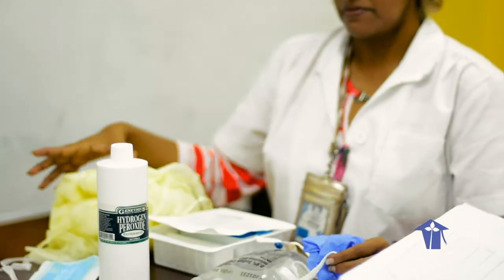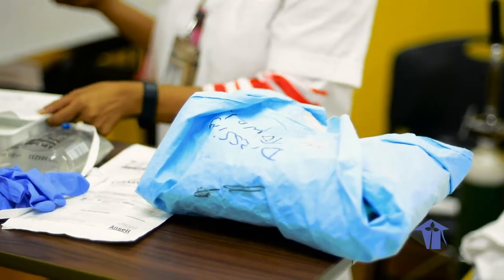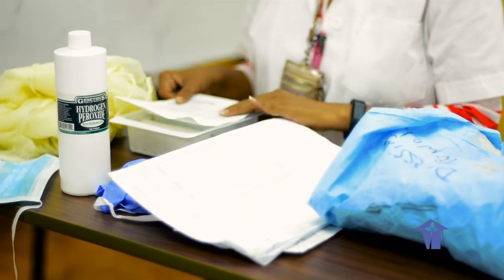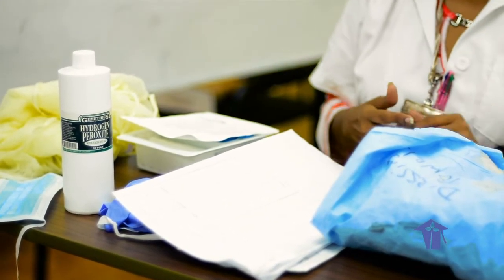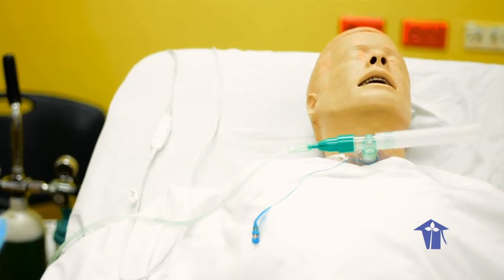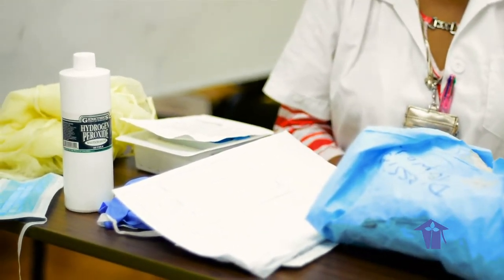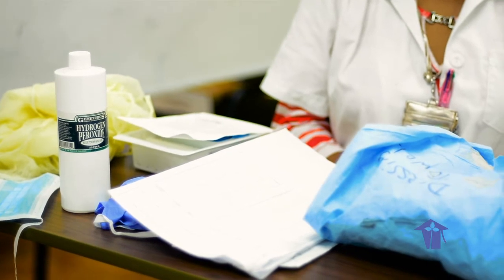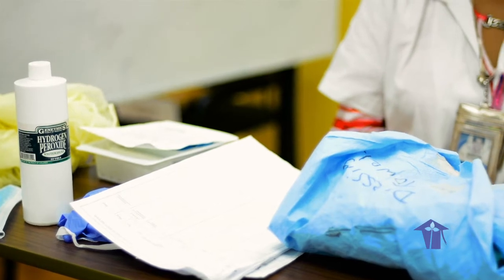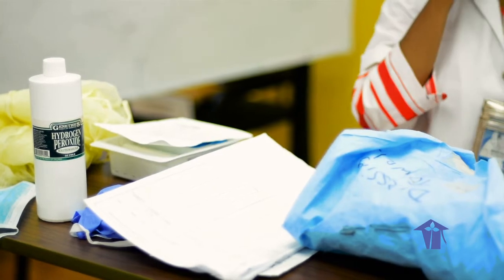We will have a sterile pack, as you see there in blue, which will consist of sterile normal saline, a sterile cup, sterile cotton, sterile gauze, and the disposable inner tracheostomy cannula will be on your patient, a sterile suction catheter and glove set, a plastic disposable bag, which will be in your bin, and a nurse if you need. So now we'll carry on to the actual procedure.